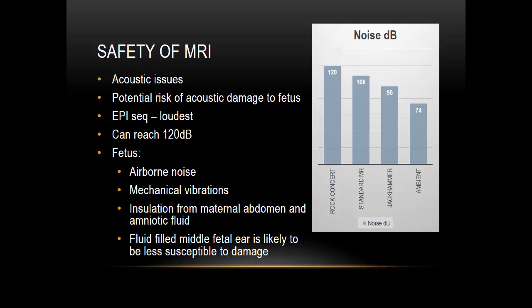Now, in terms of acoustic issues, that's another concern that we have. It can potentially cause damage to the fetus. You give the mother earplugs, and that helps a little bit. But what do you do about the fetus? You can see that the EPI sequences that we use are the loudest, and you can reach almost 120 decibels. 120 decibels is like a rock concert. And if you reach that level, does that cause harm in the fetus? So one of the things to remember is that the noise that reaches the fetus is not airborne noise.